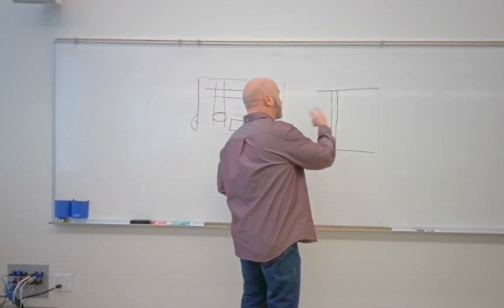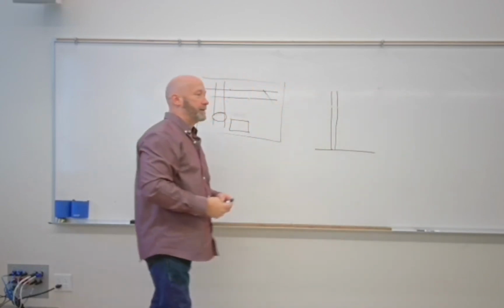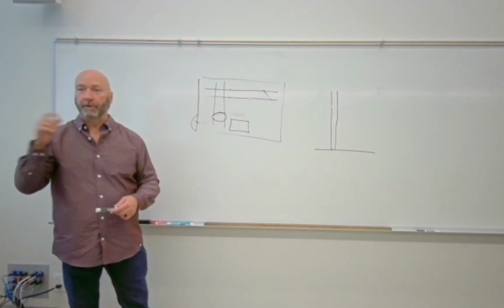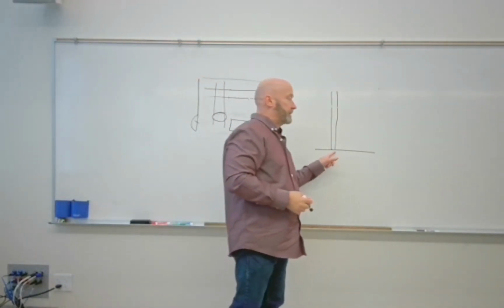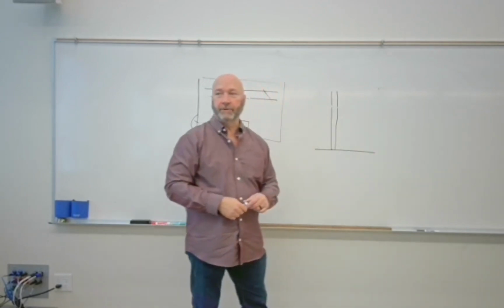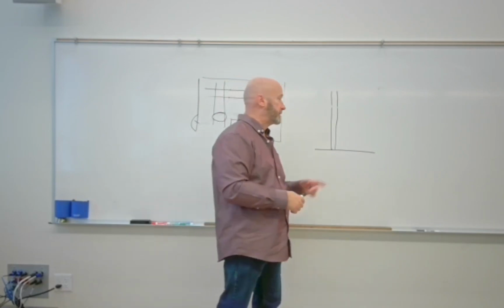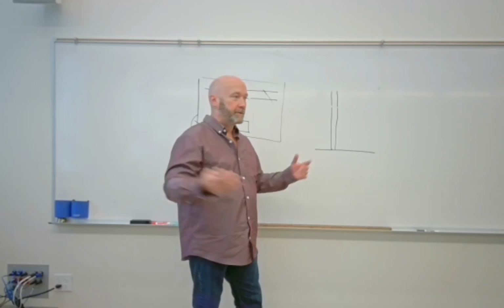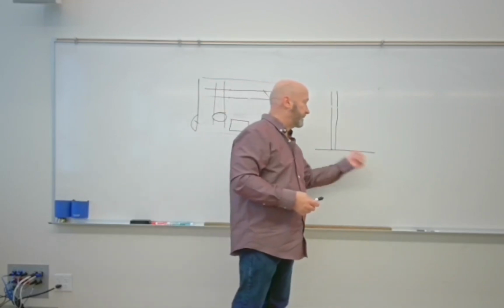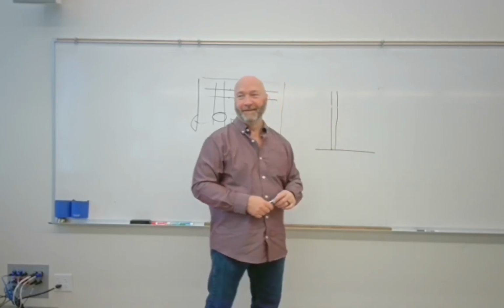There is a subset of that, which is just a floor mounted system, and those are kind of wonky. That's what we used to have over in the Pearl building before we built this one. And the problem with this one is sometimes it'll hop track. So, there were at least 2 incidents that I can remember where, because I used to be a lab instructor, I heard a loud crash, and I walk in, this thing's laying on the floor.